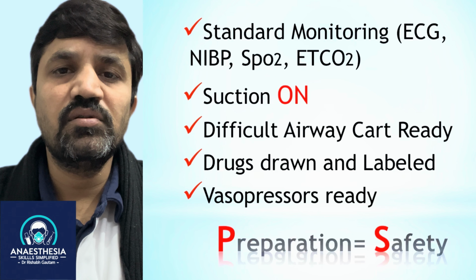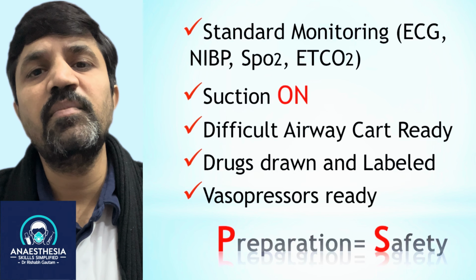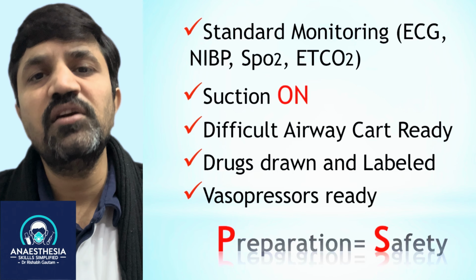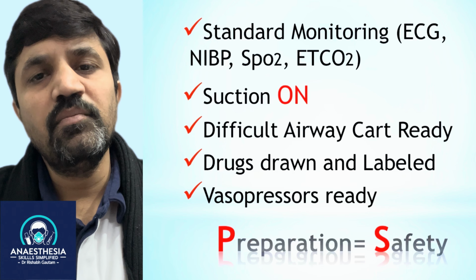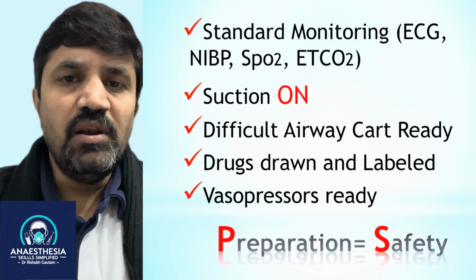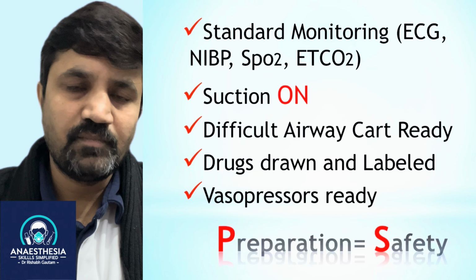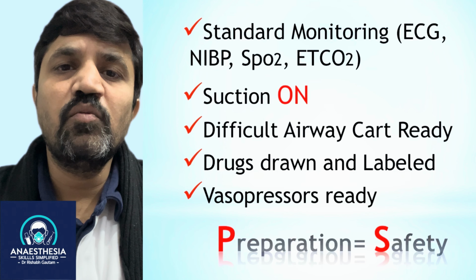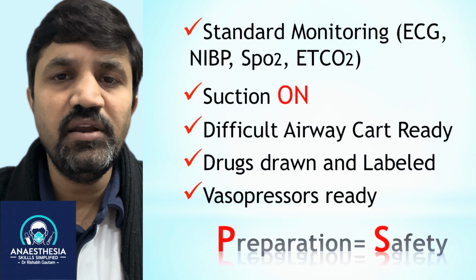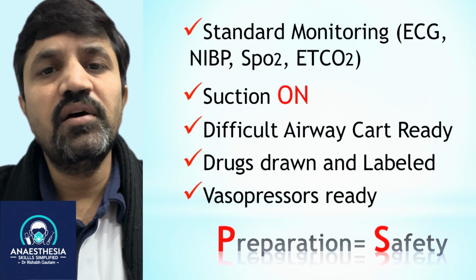So prepare all the machines, prepare your equipment, prepare your difficult airway cart, prepare your suction, switch on your suction machine and put the suction catheter near the head end of the patient before induction. Label all the drugs, keep your vasopressors ready. Keep all emergency equipment ready. Keep your plan B always ready in your mind in case of difficult airway. Keep your difficult airway cart ready.